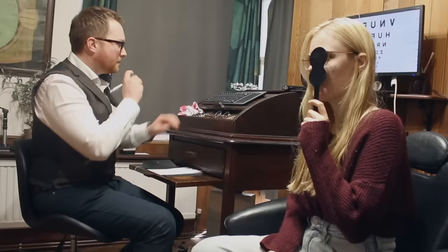V O. Yep. N P R. Very good, excellent. And if I get you to cover up your other eye now, I'm just going to jumble those letters up again. And D N V R H.